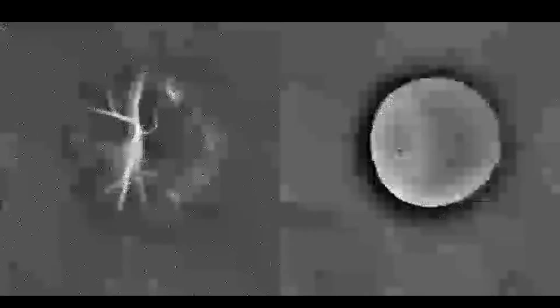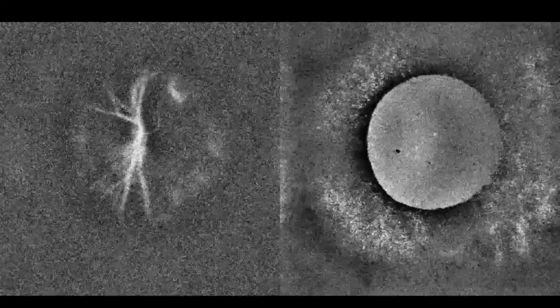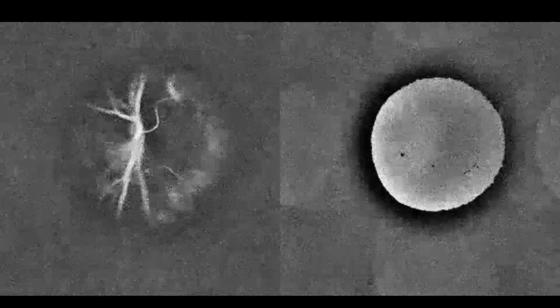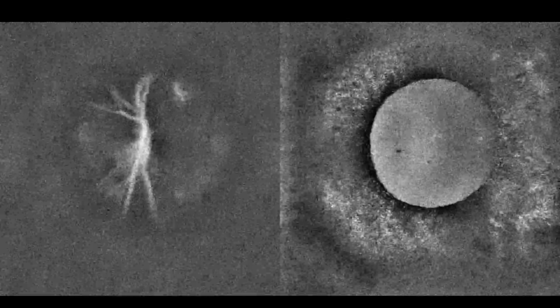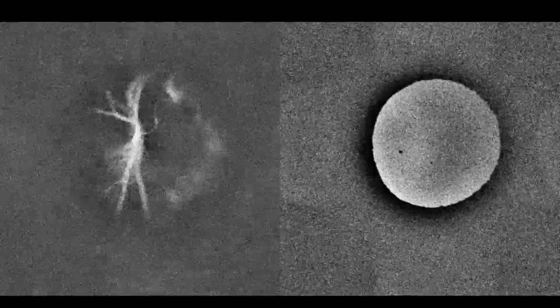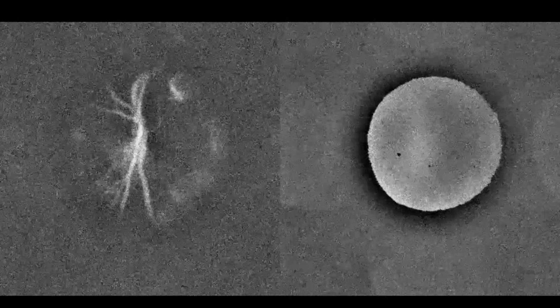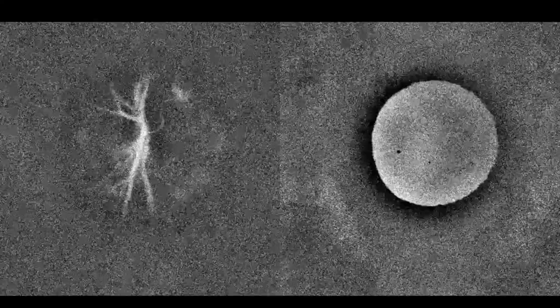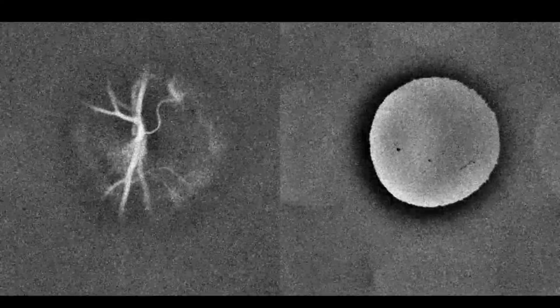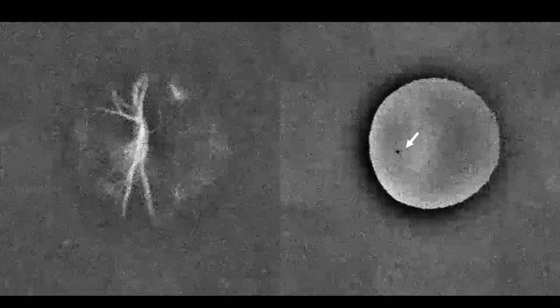Right, so here are the blood flow movies corresponding to these measurements. On the left, reconstructed in the retina, where you can see the retinal blood flow, and on the right you can see the defocused light from the retina in the pupil plane, so that you can see the sharp contour of the pupil that obstructs the light. Here the blood flow movies are reconstructed with a larger short-term window size than the one we use for the registration, because otherwise it wouldn't be very pretty for the movie, but we can use a much shorter short-term window for the registration.